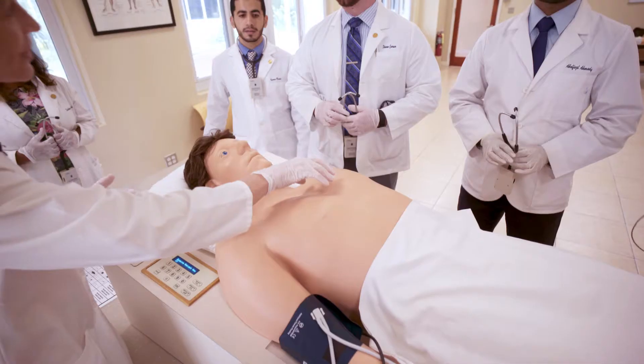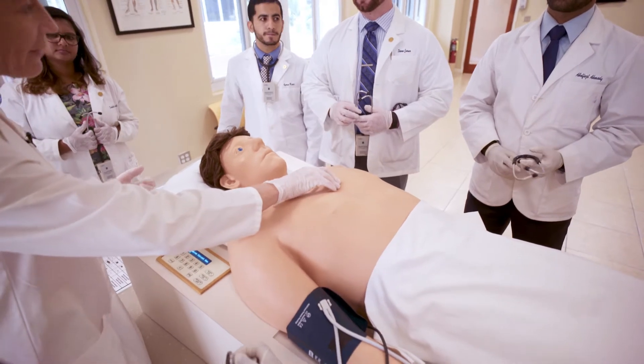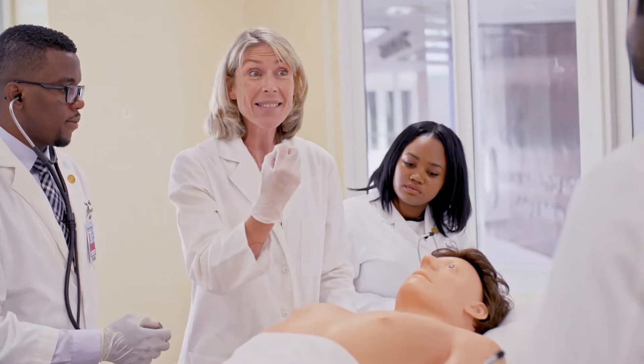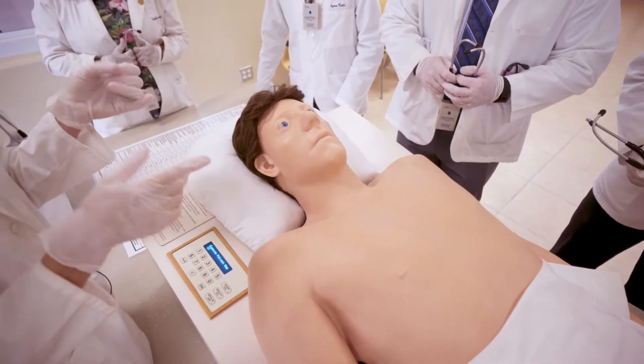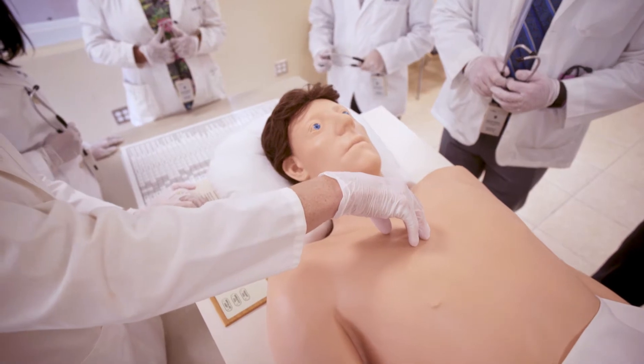As you auscultate, what are you going to hear right away? What does everybody have in their heart, hopefully if it's working? An S1 and S2. An obstruction like we have here, you're expecting a systolic murmur. So if you are predicting what you're going to hear, you think I'm going to hear a systolic murmur heard loudest over the aortic valve, which is the second intercostal on the right.